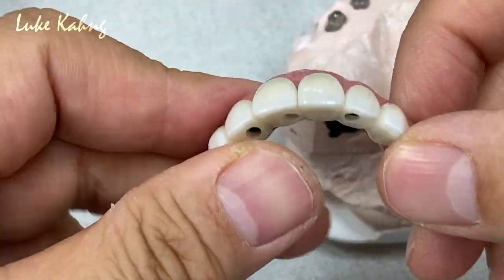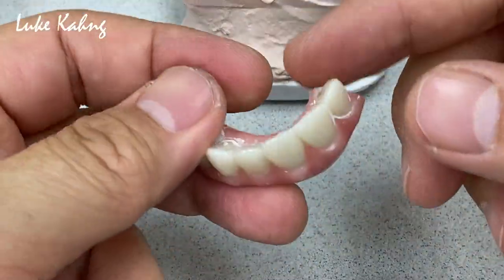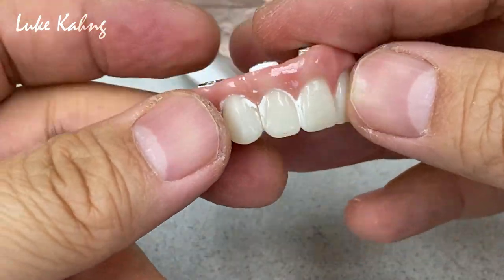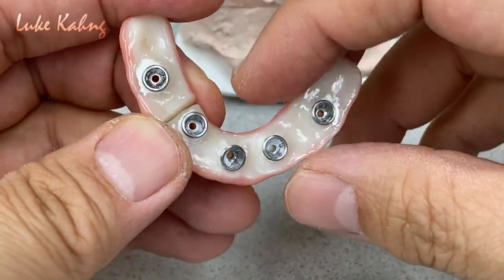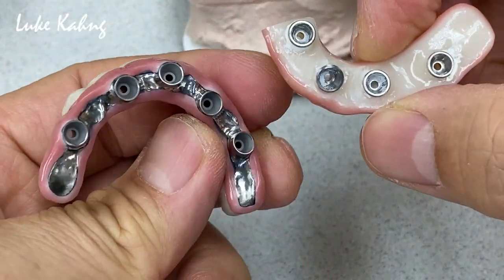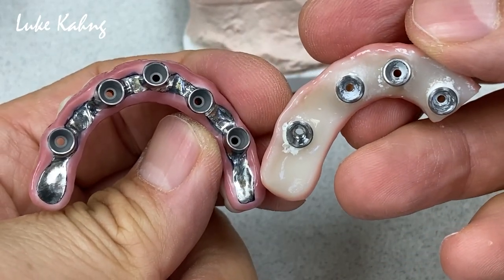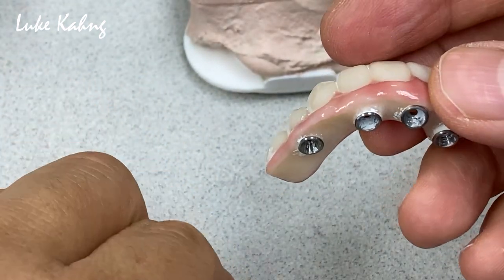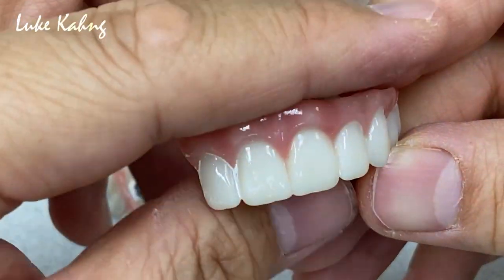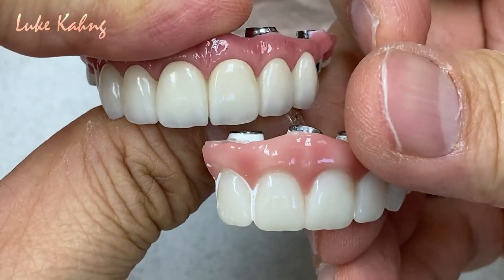So now we're trying to solve the problems. Another lab fabricated the zirconia monos, and they kept on breaking about here, okay? So not only this, we decreased the width. It's a lot of huge differences, which is the facial and lingual, thin as possible, and we extended. Not only is this aesthetics, we changed it from here. Okay, and there. This is a huge difference.